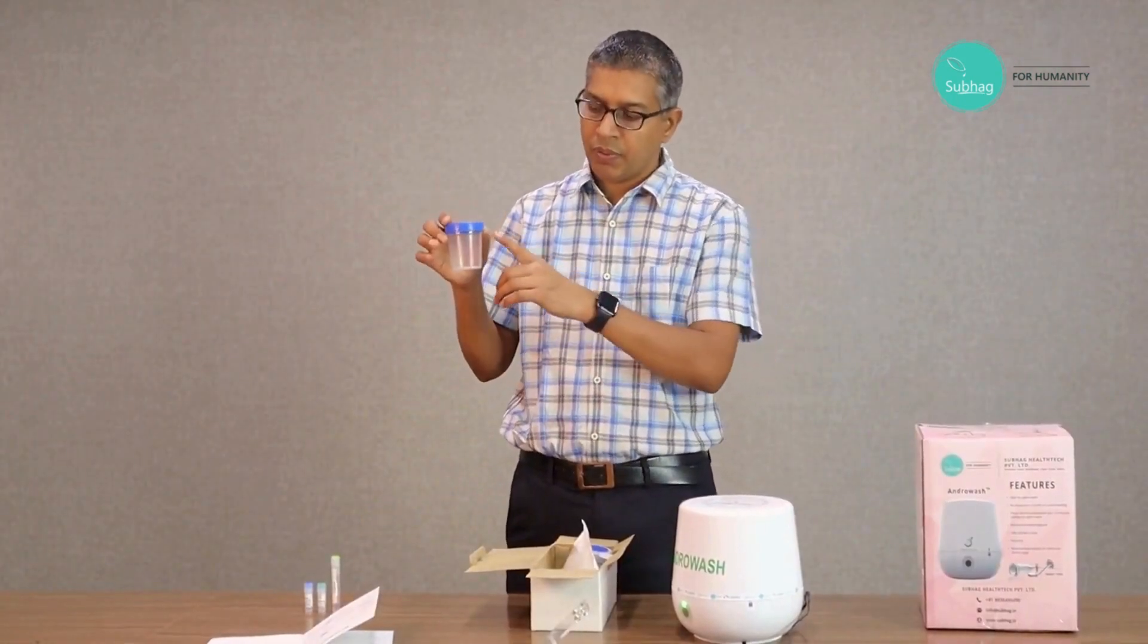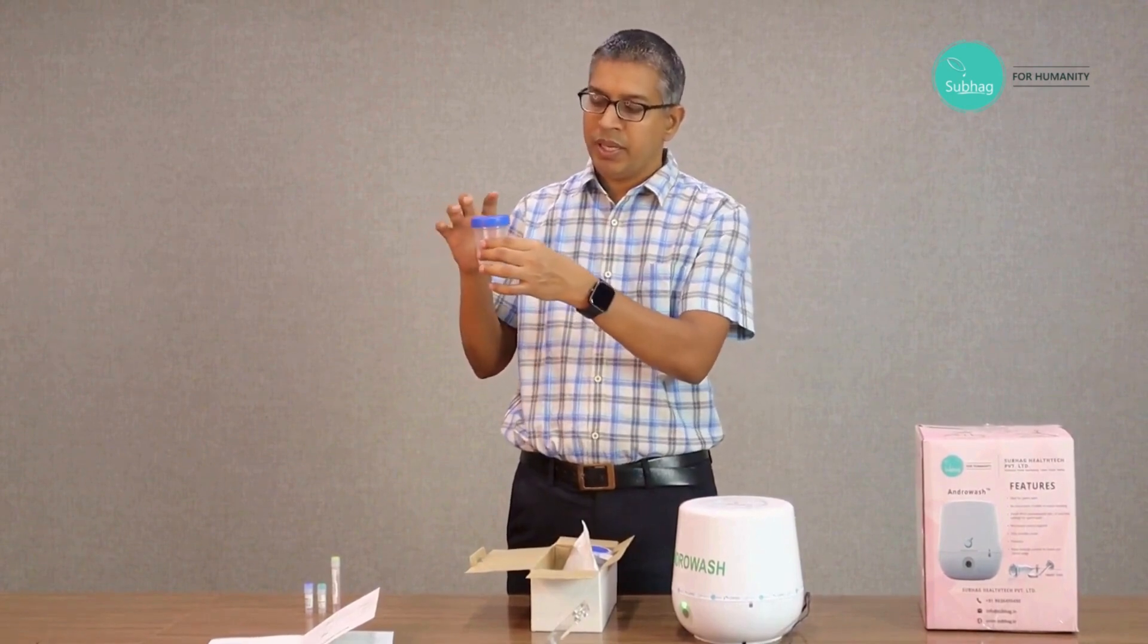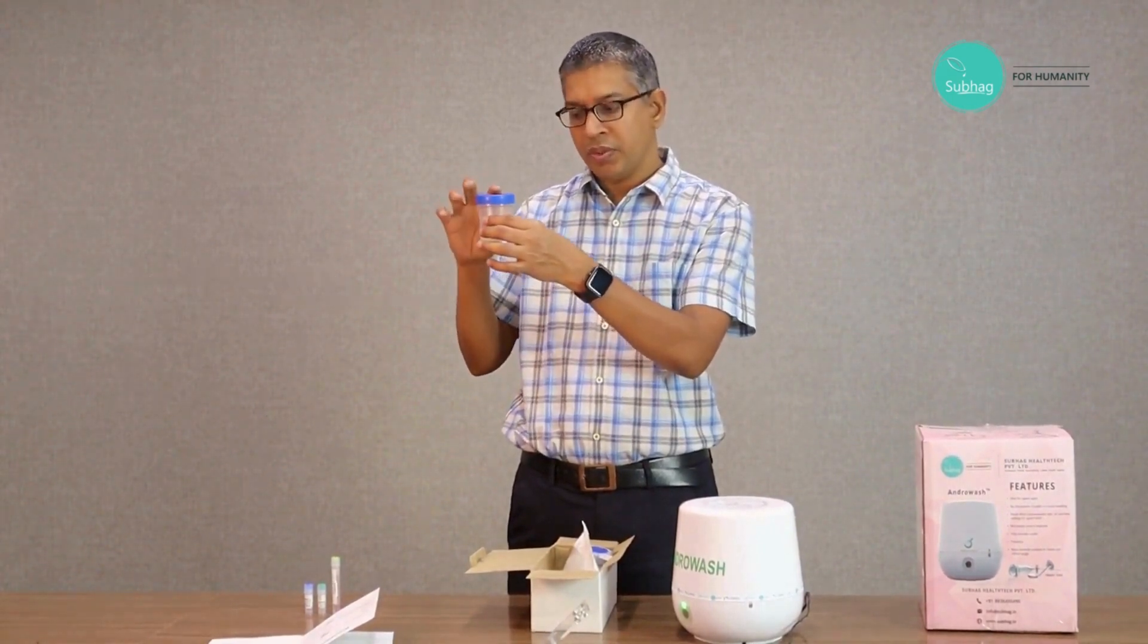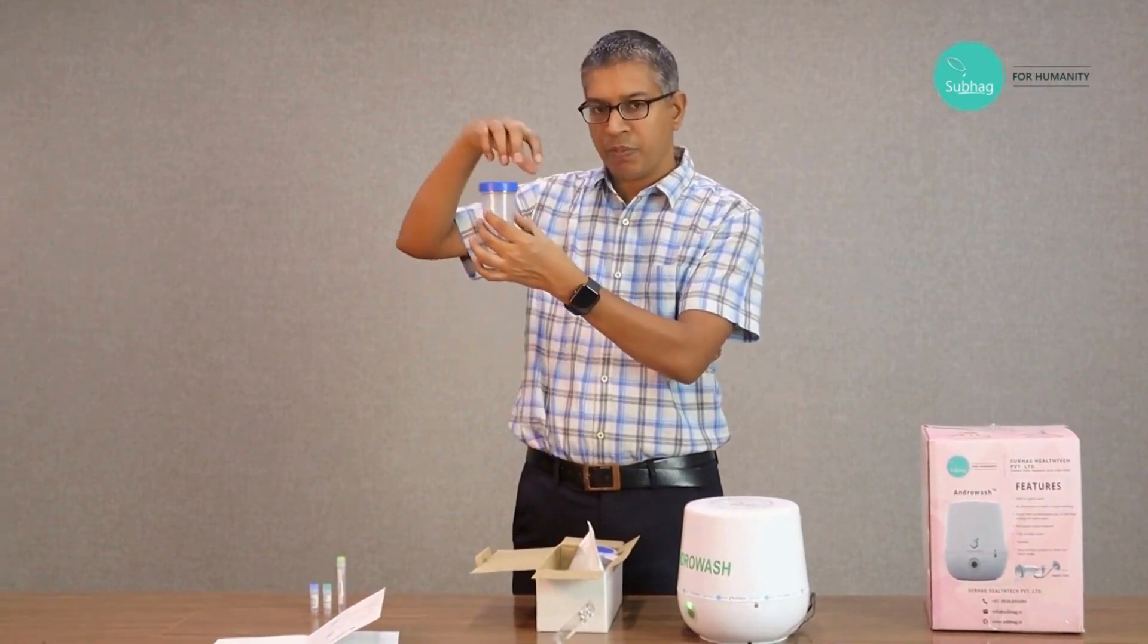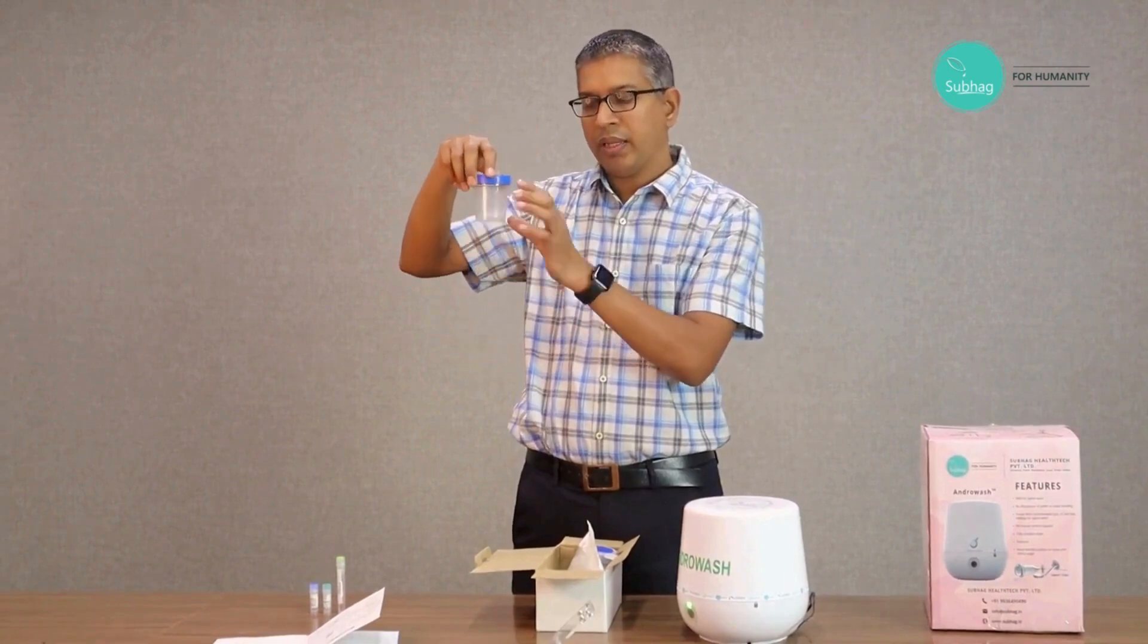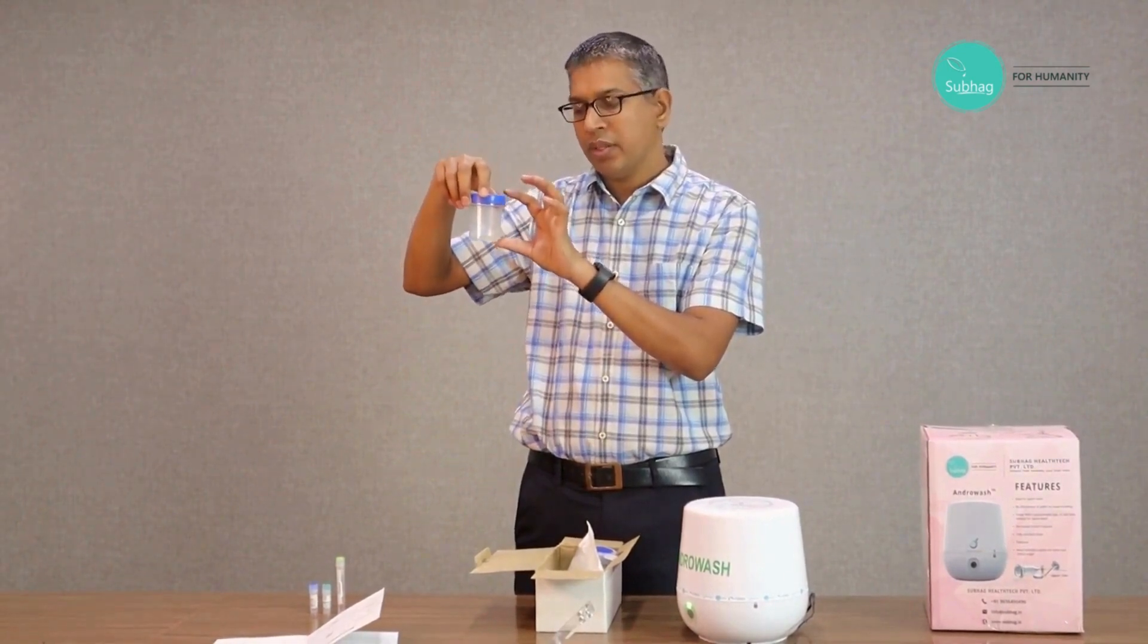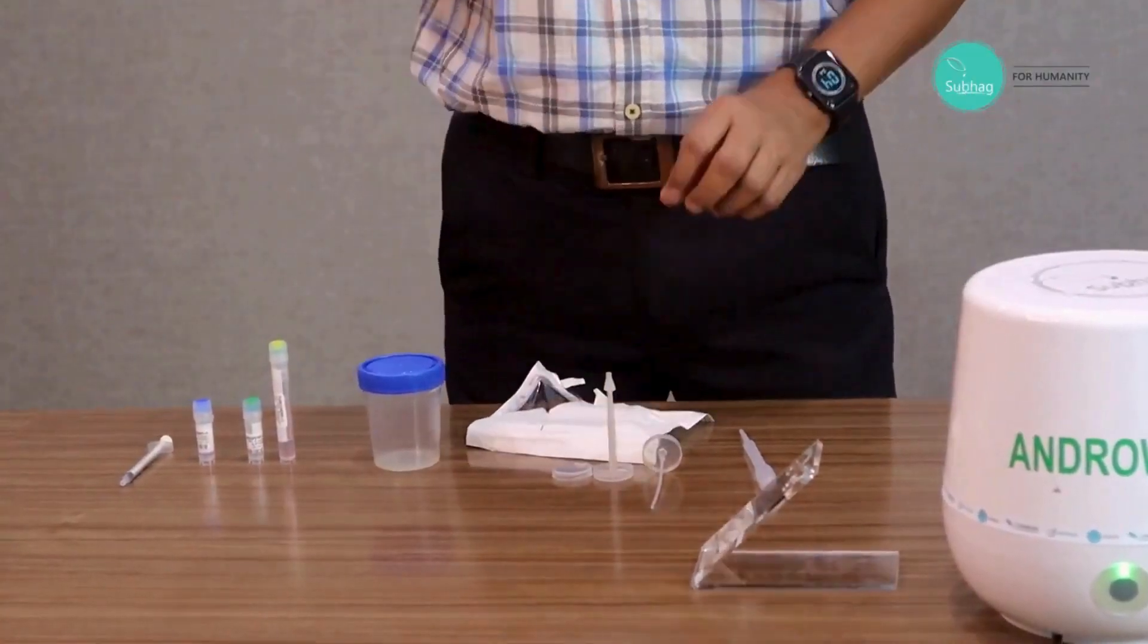As step number one, first what we need is the semen sample. The husband is provided with a sterile container, so he ejaculates into this, and then the cap is put back onto it. Then this is left in room temperature for half an hour so that it gets liquefied. To start the washing, we take the centrifuge tube.